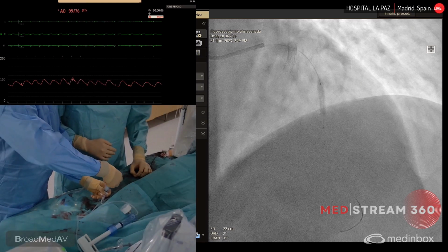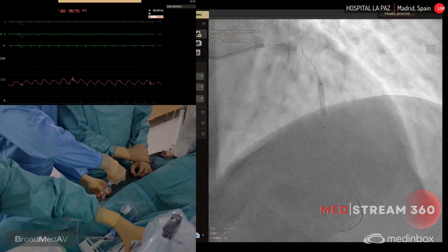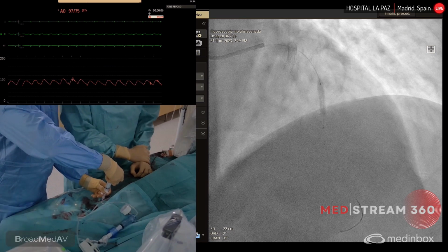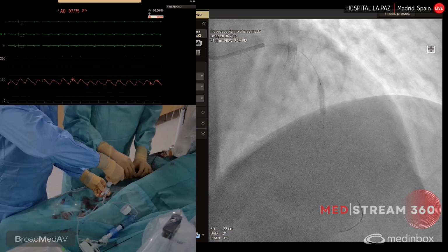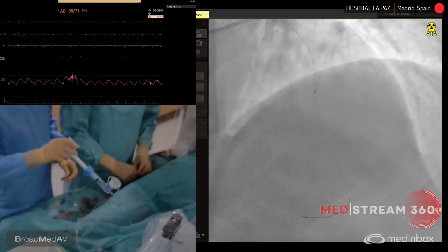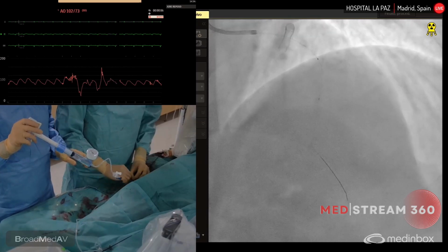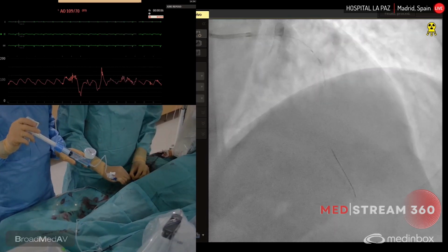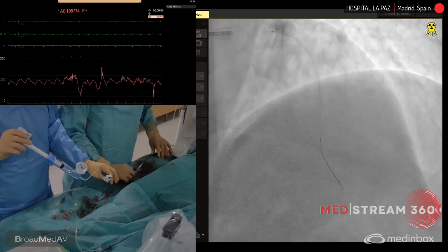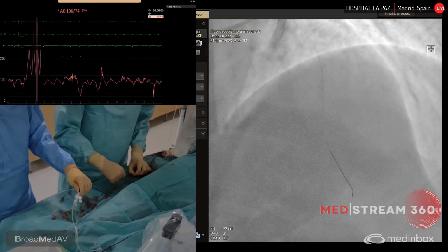So we can review it with OCT again? Yep. I'm thinking about the deterioration of flow. What can it be? Probably these are ectatic vessels. I have this suspicion that there would be thrombus inside the lesion, but in the OCT there is no thrombus. Yeah, probably it's a good point of vulnerable plaque.